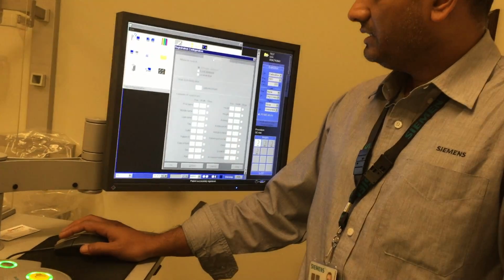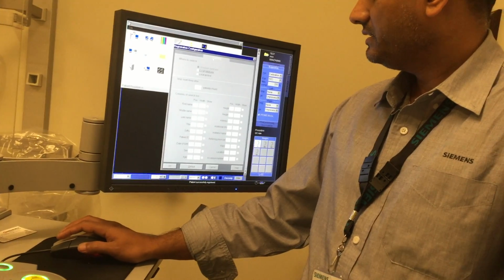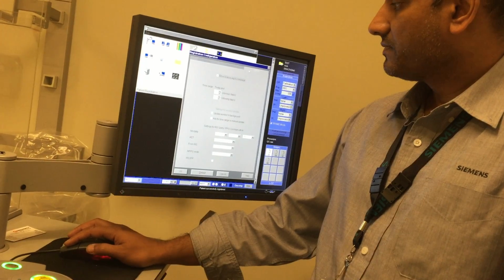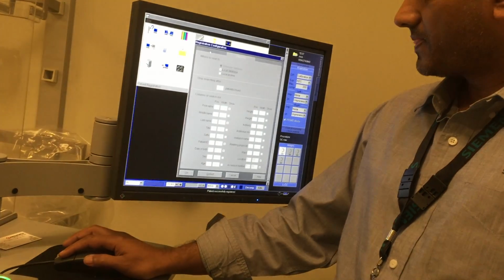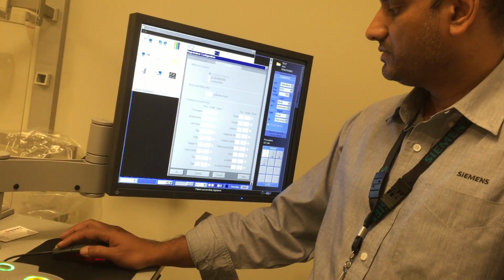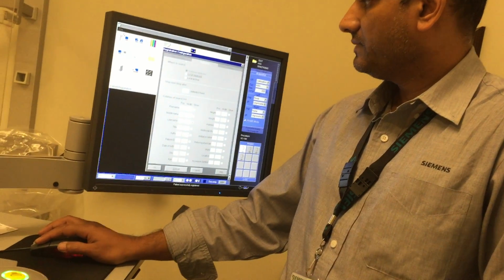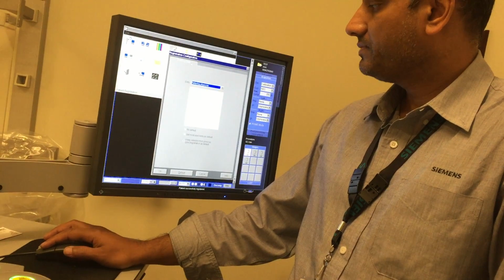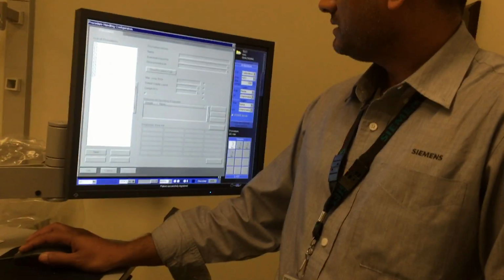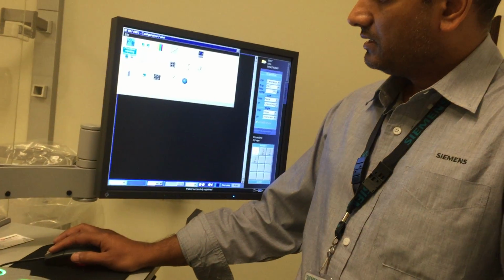There are different criteria you can set for the searching, scheduler, histories. So we actually, service helped to set up those worklist and history settings. This one is from the apps, our Siemens apps. Those procedure handlings are also from the Siemens apps, all those tabs from the Siemens apps.